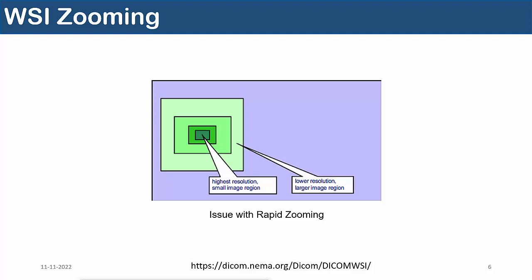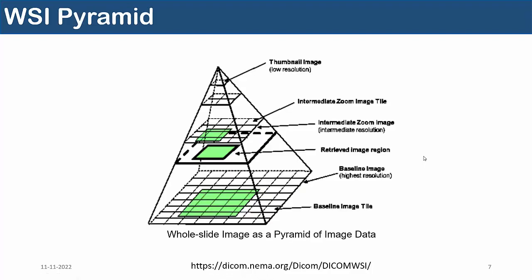One of the ways to go about this is the pyramid architecture, and this is what WSIs, whole slide images, are stored as. You have a base where you have a detailed picture, and then there are different levels that you form out of it. You pre-compute the lower resolution versions of the image, typically spaced by some power of 2.